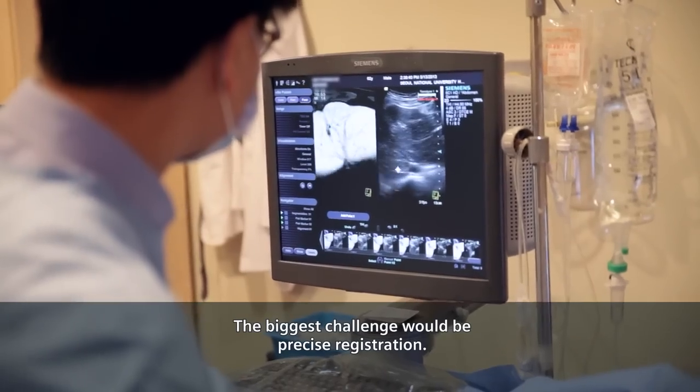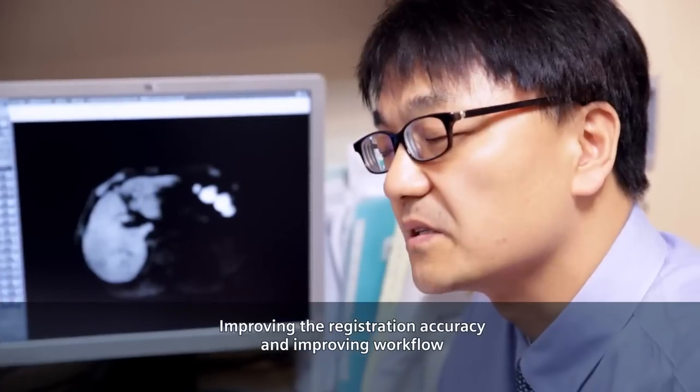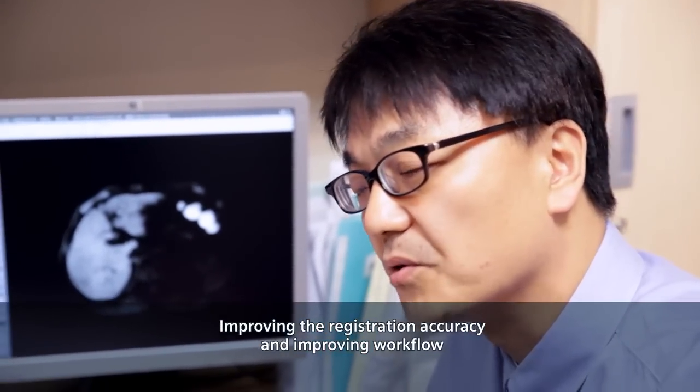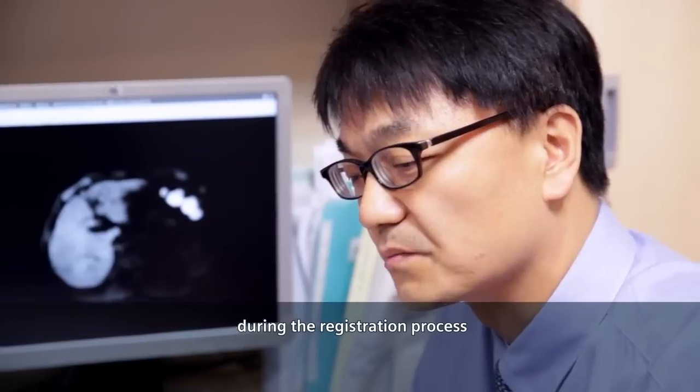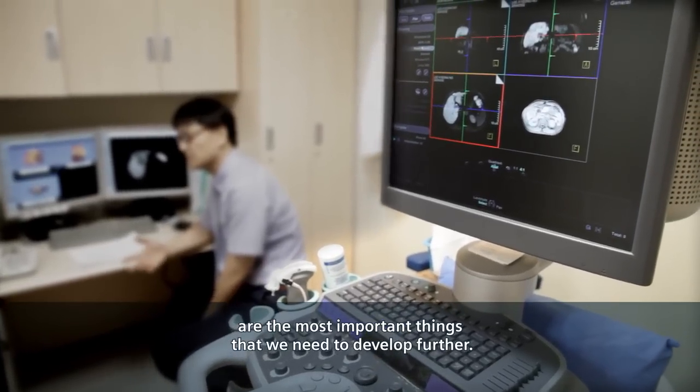The biggest challenge would be precise registration. Improving the registration accuracy and improving workflow during the registration process would be the most important things we need to develop further.